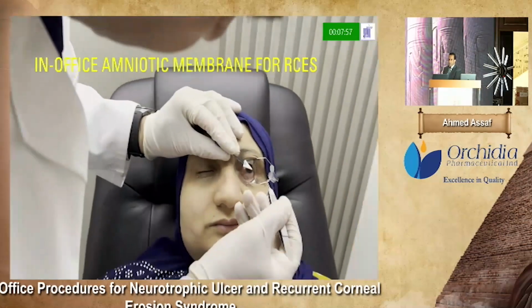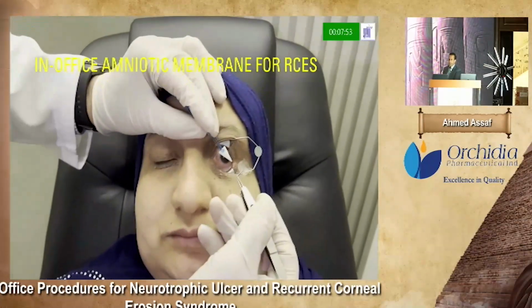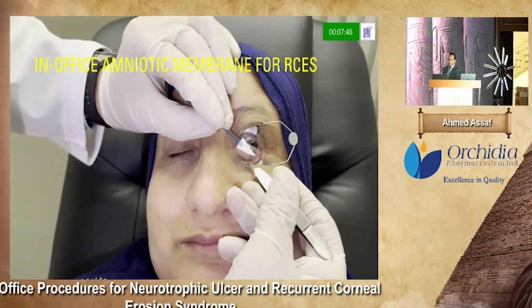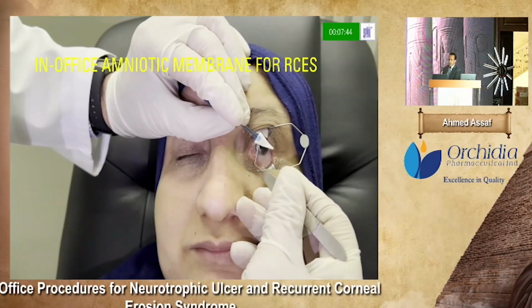The most important thing is to dry the cornea completely. Make sure that the cornea is extremely dry before applying the amniotic membrane on the debrided corneal epithelium. And then we can apply a bandage contact lens.